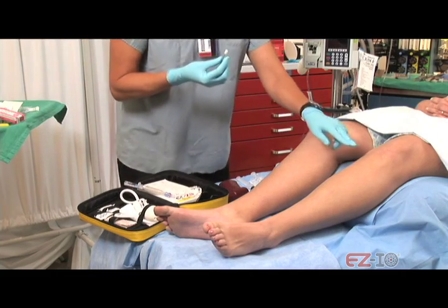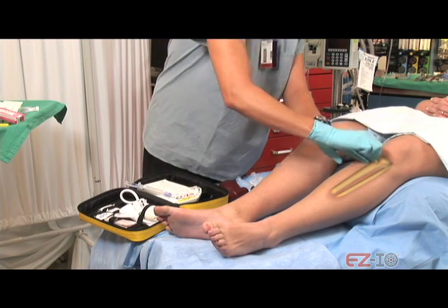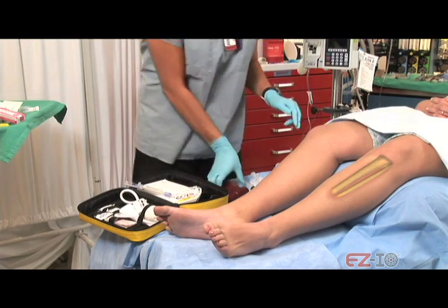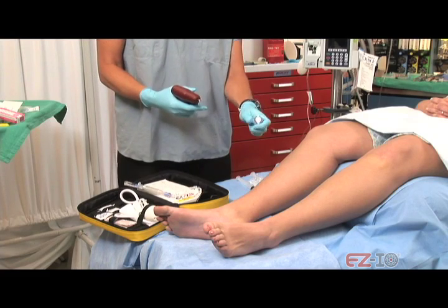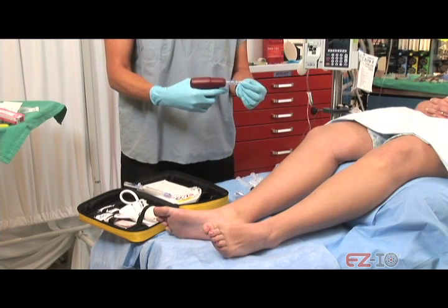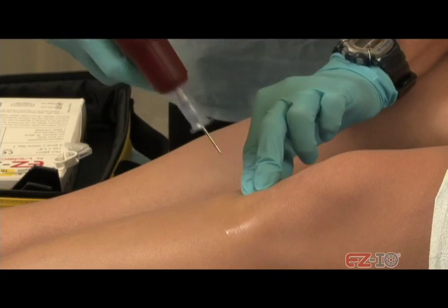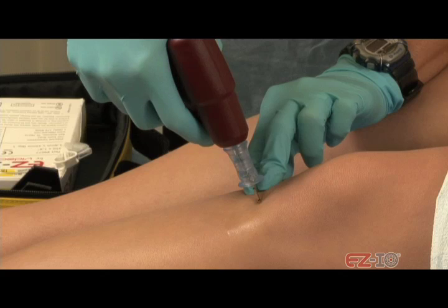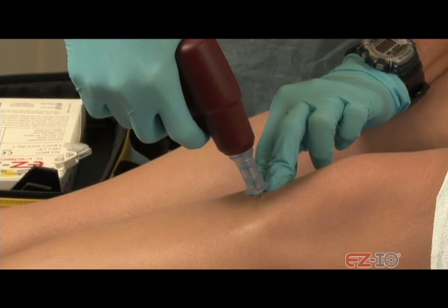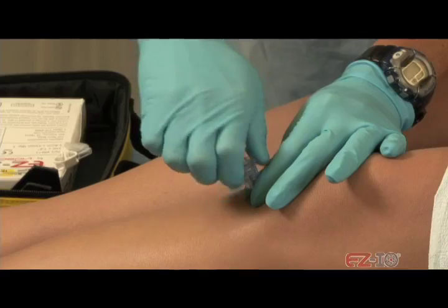Okay, now I'll let you know before I'm going to put it in, okay? I'm just finding the spot where I'm going to put it. Are you ready? Mm-hmm. Okay, quick poke. Ready? 1, 2, 3. Okay. How was that? That's all right. Doing okay? Mm-hmm.